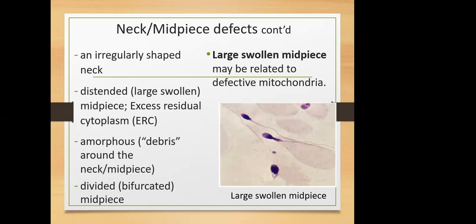But if it is larger, then it becomes, as you know, excess. And this excess is likely to contain a lot of ROS, reactive oxygen species. And remember, we said that reactive oxygen species cause a lot of danger to the cell in question. All right. So excess residual cytoplasm is a larger portion of the cytoplasmic droplets, and they are pathological. They are not normal. All right.